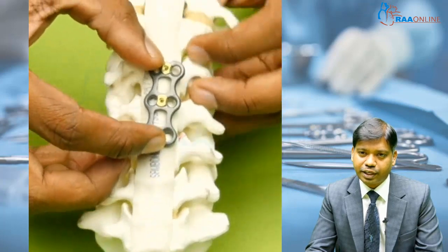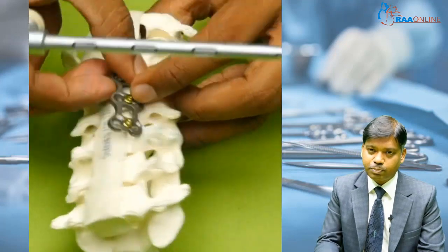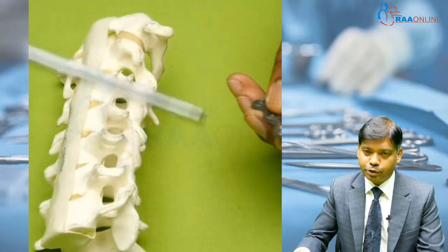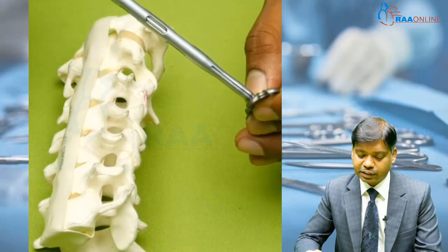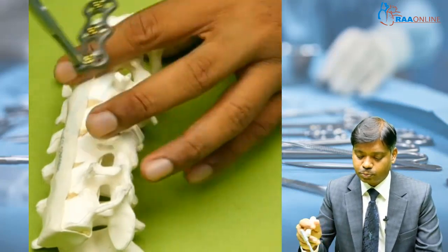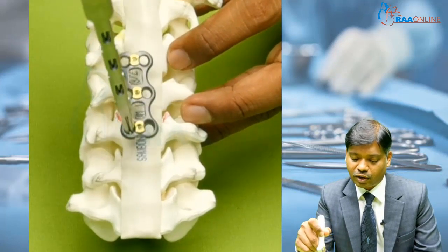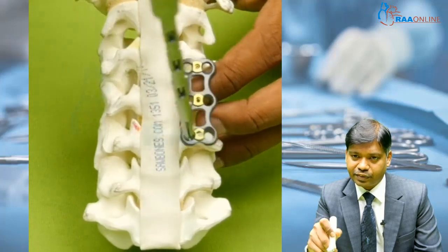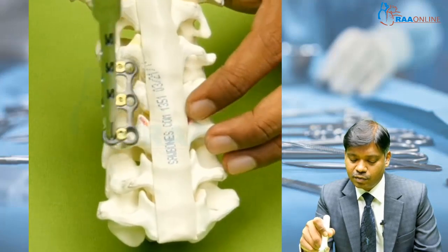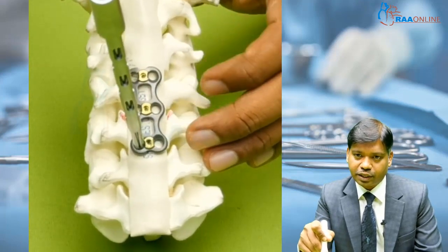The plate has to be in the center in the AP view, and you have something called the plate holder. You push this plate holder so that it goes and snugly fits inside the plate, and using this plate holder you will be able to place the plate like this or wherever you want. This is very important because you will be retracting the esophagus and trachea on this side, the carotid sheath on the opposite side, and you can use this to place the plate.